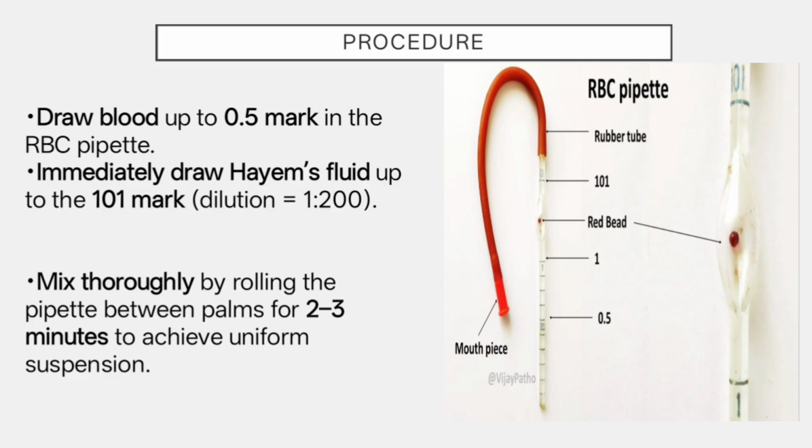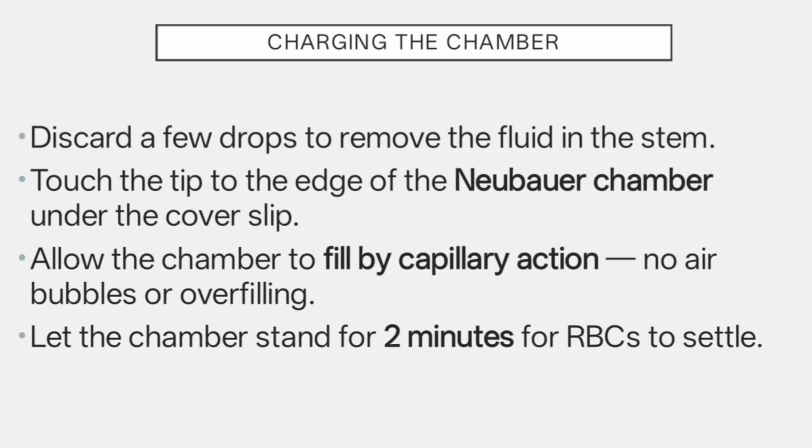Now after that, mix thoroughly by rolling the pipette between the palms for 2 to 3 minutes to achieve a uniform suspension. After that, discard a few drops to remove the fluid in the stem.